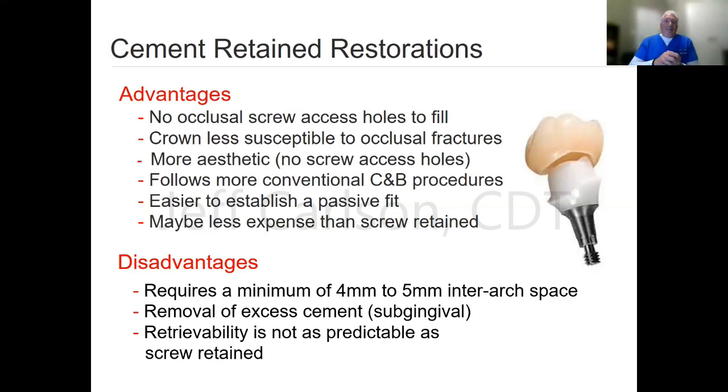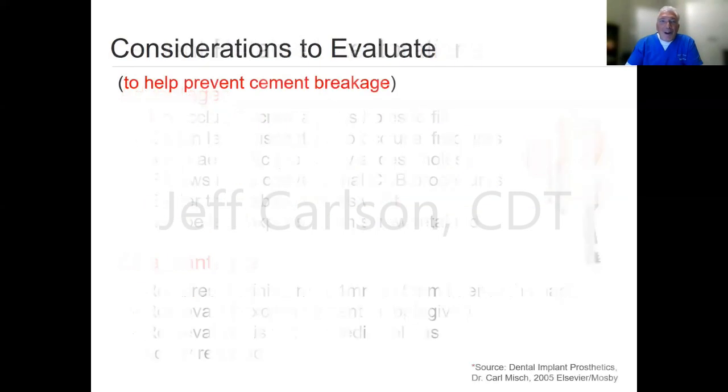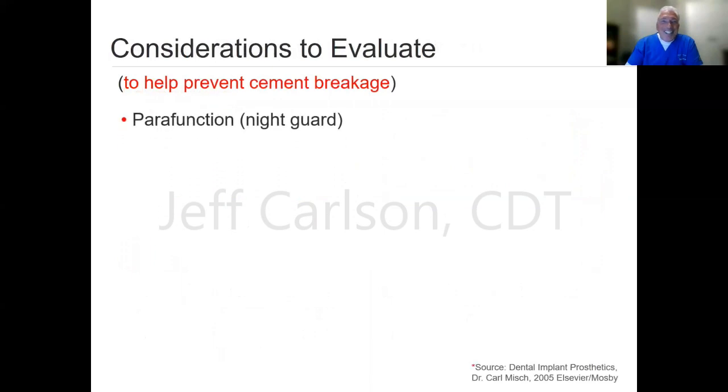Pre-cement these outside of the mouth. Put some cement in there. You can have a dye made, or even a little impression. Squirt some impression in the crown, put a burr in it, and then pull that out. There's a little pre-cementation dye. So you put cement into your crown, put that little impression dye in there, pull it out, wipe off, push it in, wipe off the excess cement, and you have just about the right amount of cement for that. That was 20 seconds. That usually takes about a minute and a half to explain.